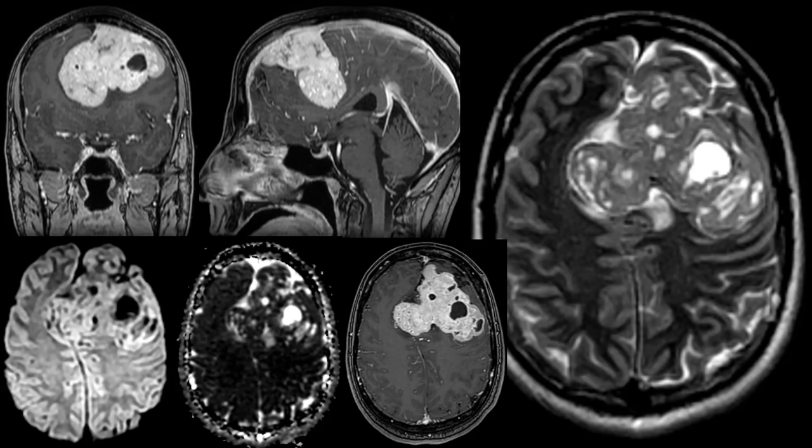What would you call the sign if it's an atypical meningioma? Mushrooming sign, exactly, which could be atypical or anaplastic. Right, this doesn't look quite as bad. Anaplastics typically are super ugly. I mean, really ugly. We've shown them in this conference before. I love atypical meningioma. Now, listen.